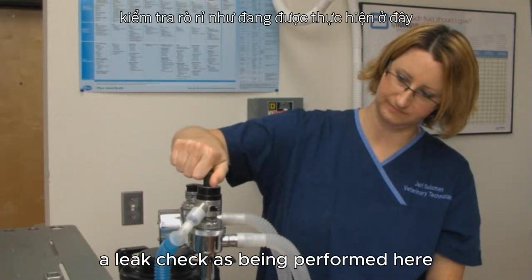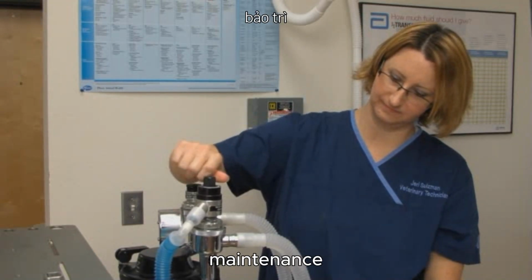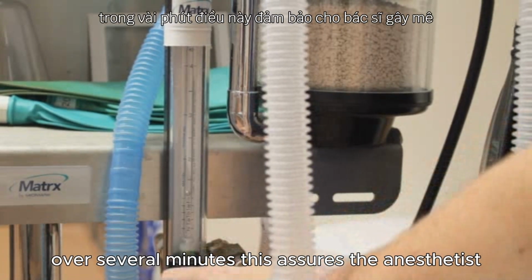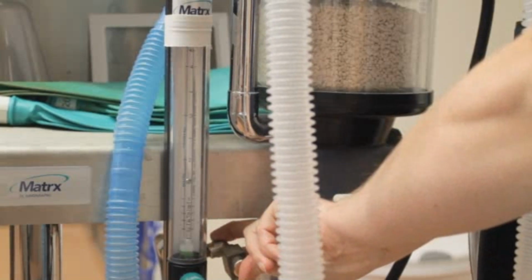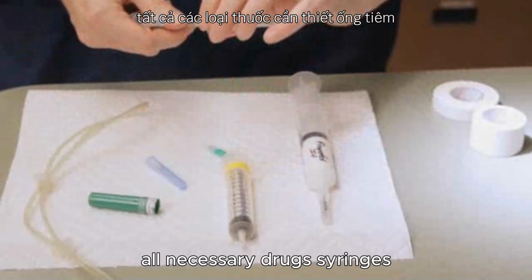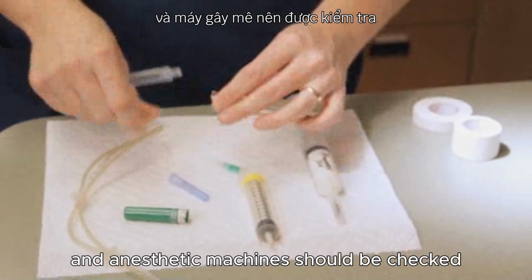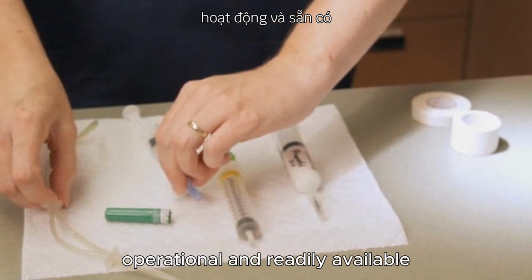A leak check, as being performed here, should be a regular part of anesthetic machine maintenance. Notice how the pressure does not drop over several minutes. This assures the anesthetist that the system does not have any leaks. All necessary drugs, syringes, endotracheal tubes, mouth gags, anesthetic monitors, and anesthetic machines should be checked, operational, and readily available.